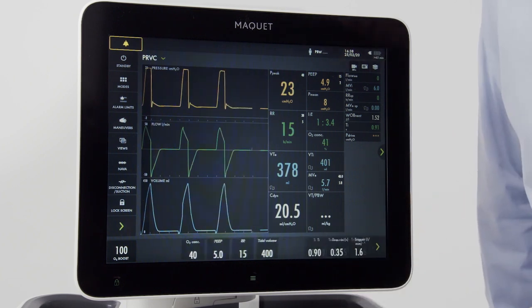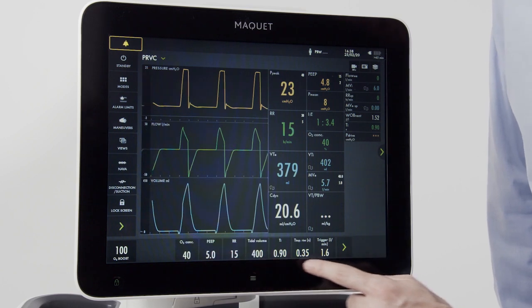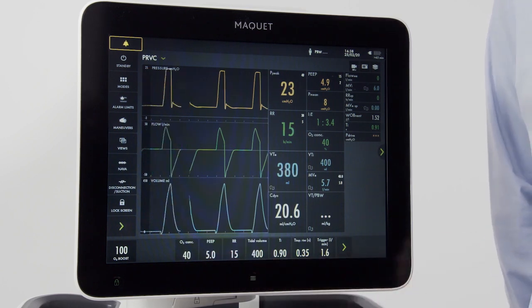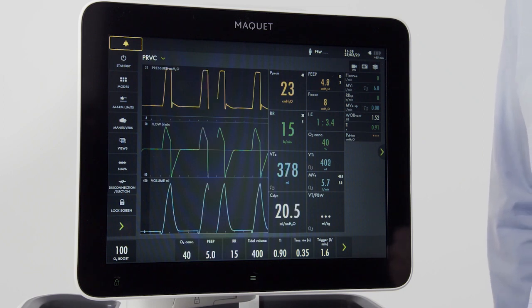When I press the mode arrow, I can see all the set parameters. By pushing those two arrows, I can see all the set and measured parameters on the screen at once.